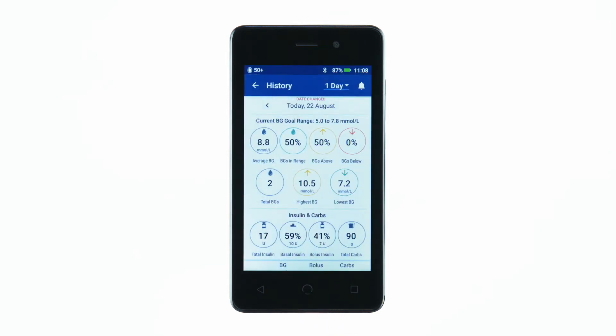From the insulin and BG history screens, you'll see a summary of all data over the selected time period. This data includes a record of carbohydrates entered into the bolus calculator.